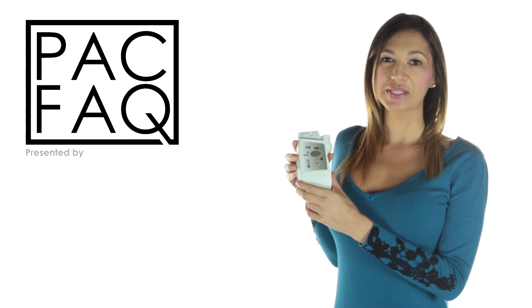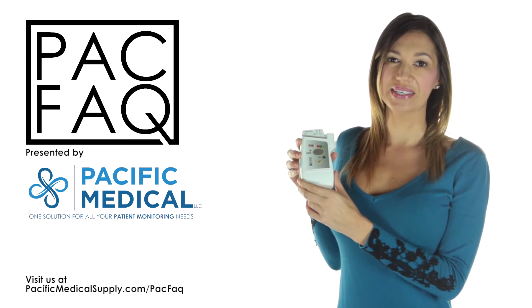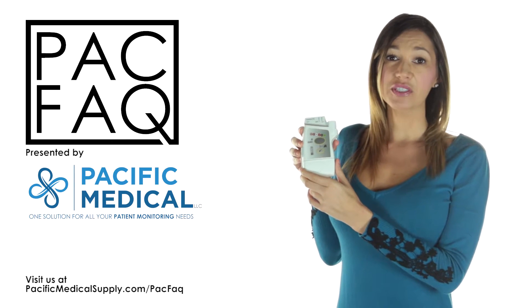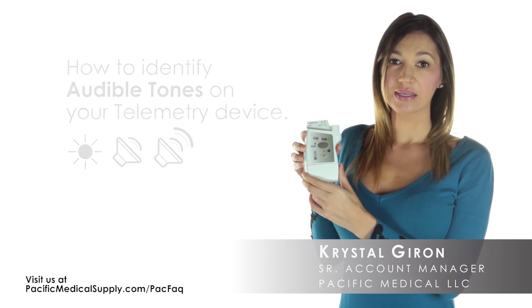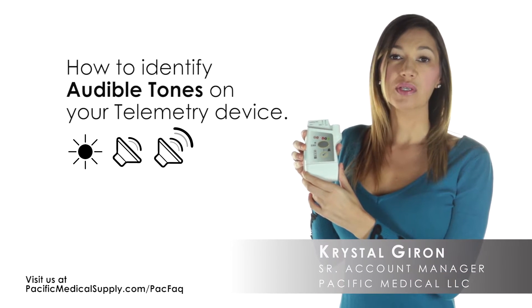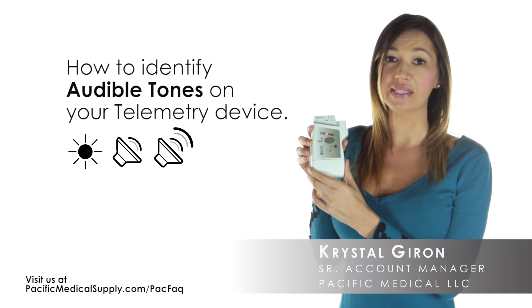Hello and welcome to another episode of Pack Facts, a short helpful video to make your job easier. Does your Philips telemetry device make any audible tone patterns and you don't know what it means? Today, we will show you the most common audible tone patterns to help you identify what your device is telling you.